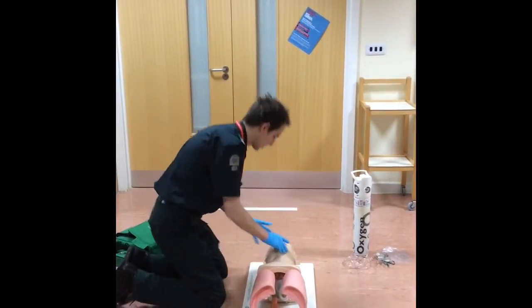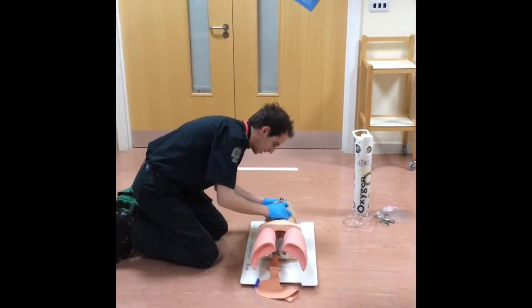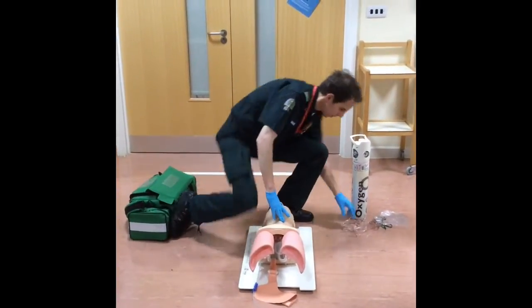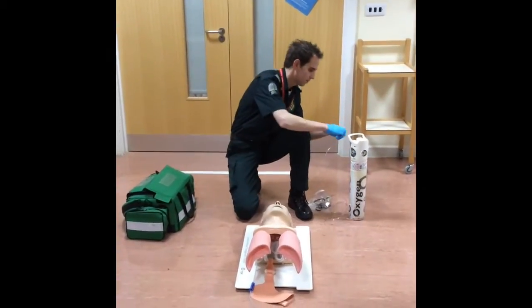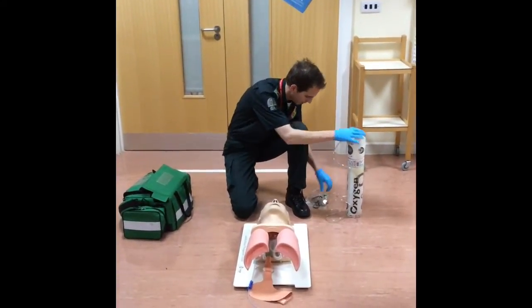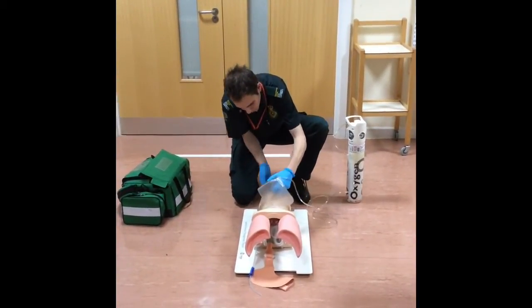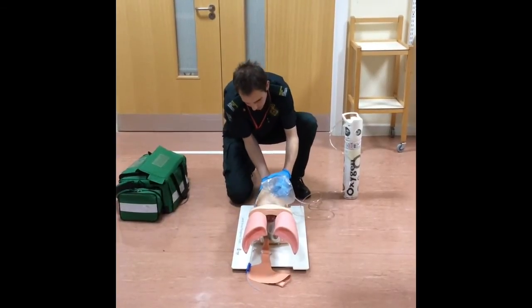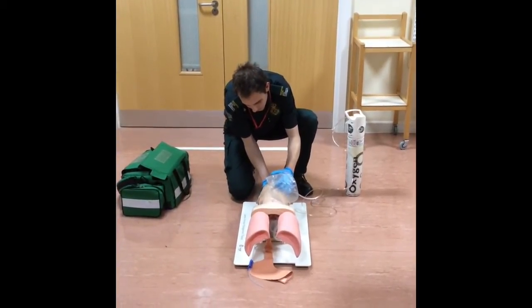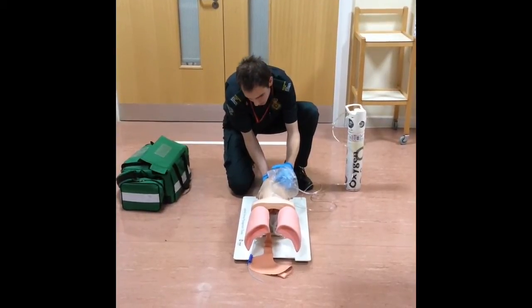There's no response to that, so have a quick look in the mouth. Considering suction, I can't see anything in the mouth, so I just think for the moment I have an airway issue, so I'm going to get the oxygen, non-rebreathing mask, high flow oxygen, inflate the bag, pop the mask on the patient, and head tilt chin lift, and see if that helps the airway. So I do that for a few seconds.